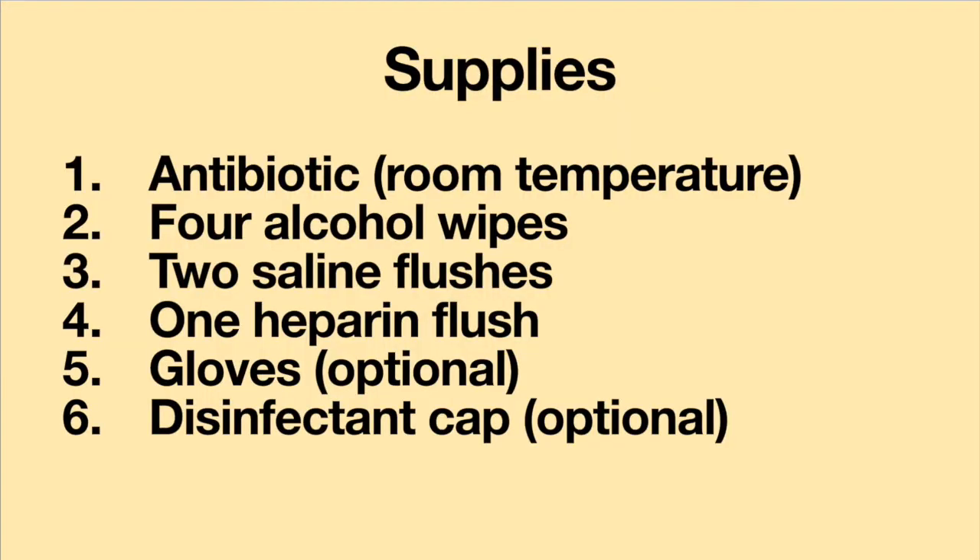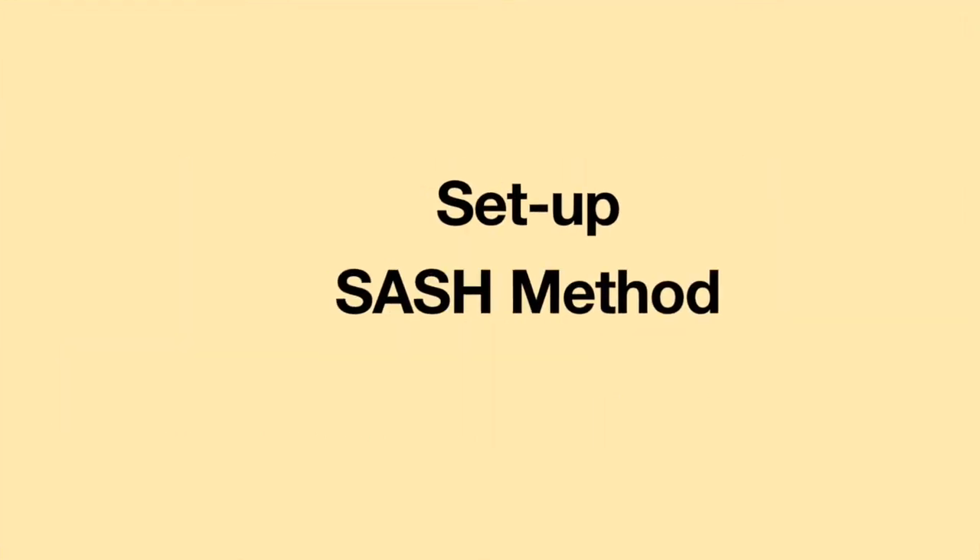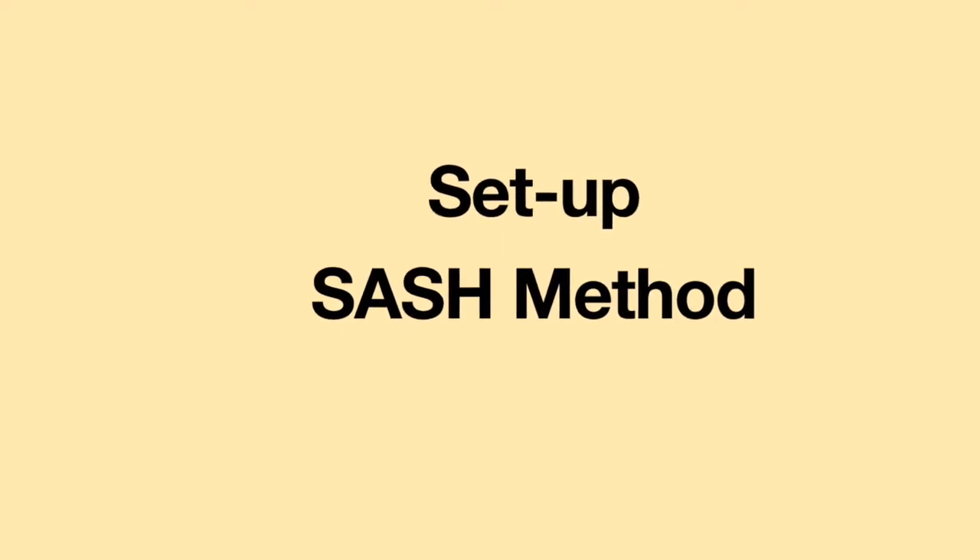Before administering the antibiotics, you will need the following items: your antibiotic at room temperature, four alcohol wipes, two saline flushes, one heparin flush, gloves (which are optional), and an optional disinfectant cap. When laying out your supplies, it is often best to place them in the order you will use them. The acronym many use is called SASH — it stands for Saline, Antibiotic, Saline, Heparin.